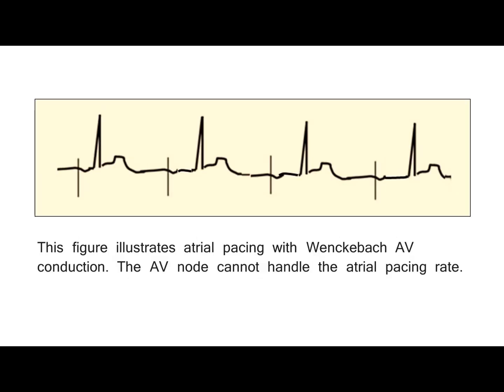This figure illustrates atrial pacing with Wenckebach AV conduction. The AV node cannot handle the atrial pacing rate.